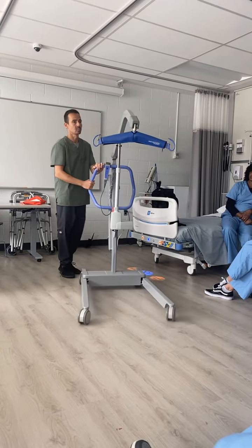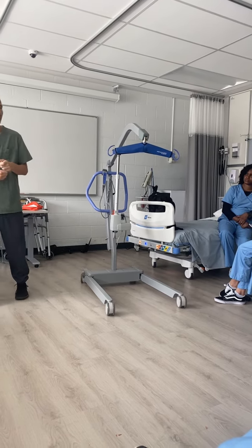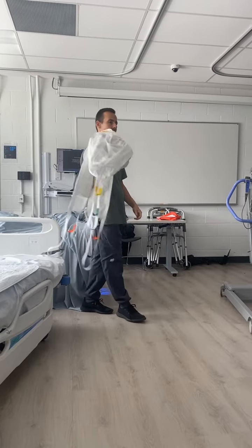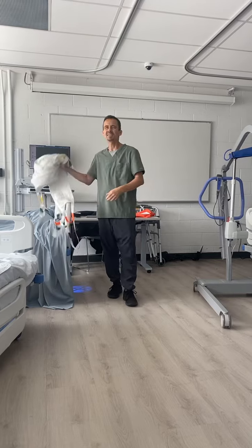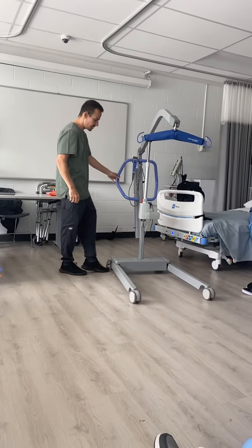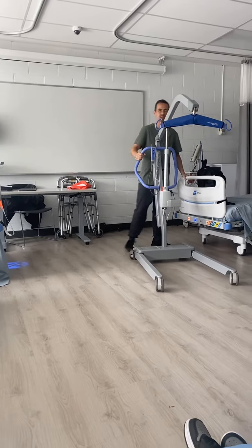It's actually Hoyer lift, right? So it's called mechanical lift or Hoyer lift. I guess these slings are also called Hoyer slings. That's why it's called either Hoyer lift or mechanical. The technical term is mechanical lift. So you would see in the chart mechanical lift transfers. That's what you would chart.